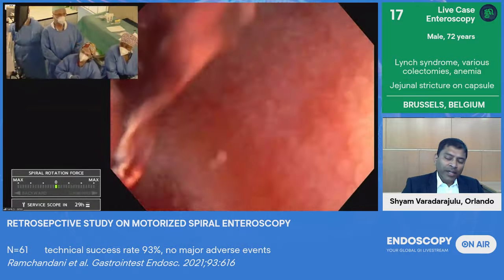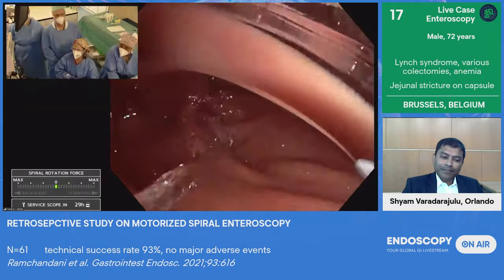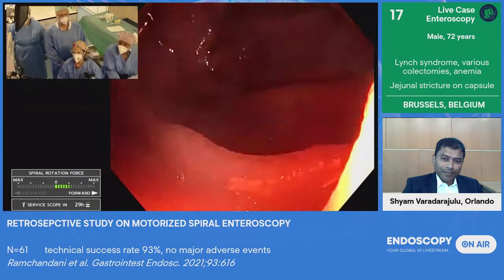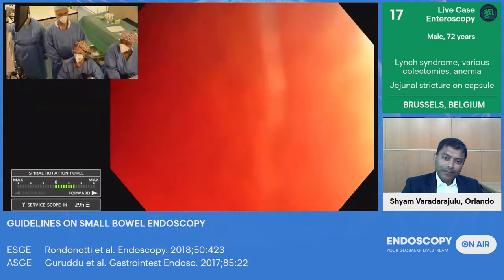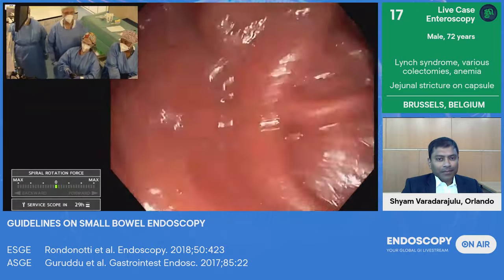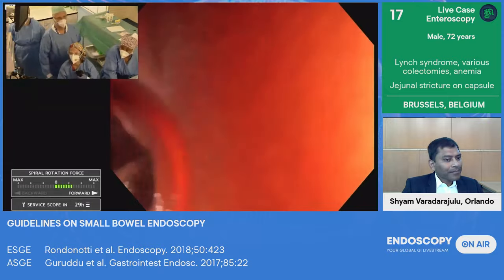How does putting water help with the propulsion of the scope? I think that putting water mainly helps in avoiding you inflating too much. What doesn't help is to inflate CO2 too much during the advancement, because it provides some distension of the small bowel and then probably less adhesion of the spiral. So we can have an underwater view also, which will mainly decrease our tendency to insufflate. Just checking here because I thought I saw something, but no.